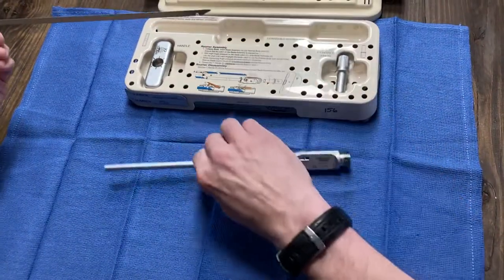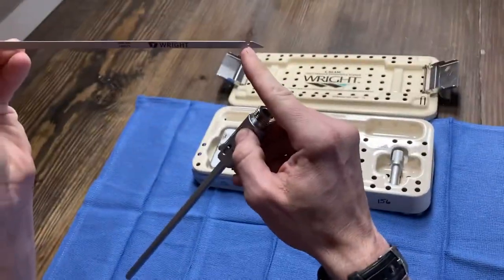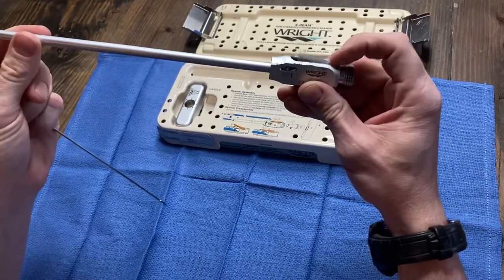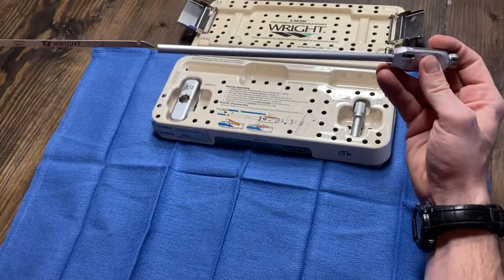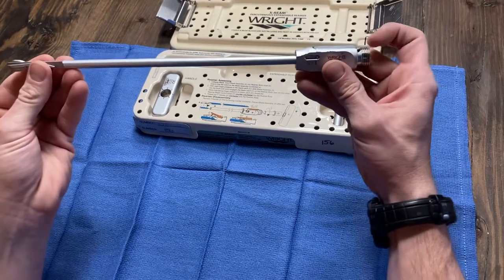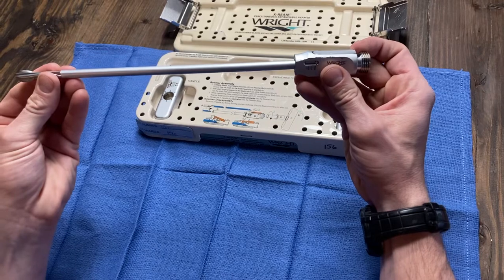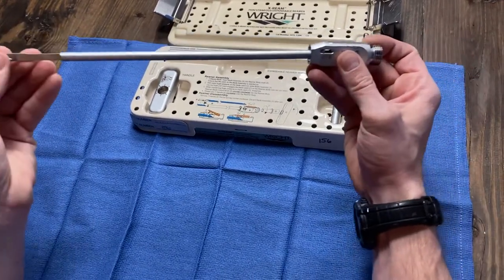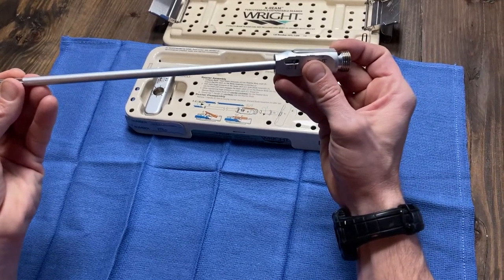First thing you do is get out this long body here, and then this notch faces the ceiling on the end of the blade, and this little teeter-totter thing here will hold that in. So you're gonna slide this blade into the end of the body. It slides all the way in and that little notch will raise that teeter-totter and then drop in. Notch up, slides in, teeter-totter goes up, drops in the notch and you're good.